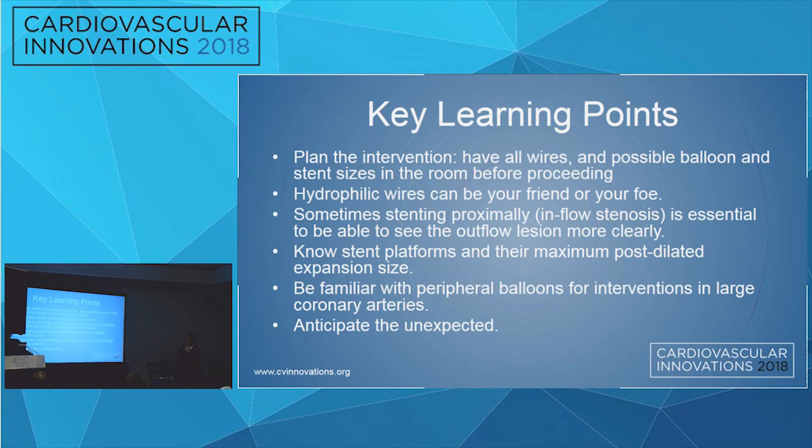Hydrophilic wires can be your friend, but they can also be your enemy. If you have a dissected right, or even if it's filled with clot, you can sometimes get underneath something, lift it, and cause further dissection, but I chose to go with one, kept the tip free, got it all the way out there, and it worked out.